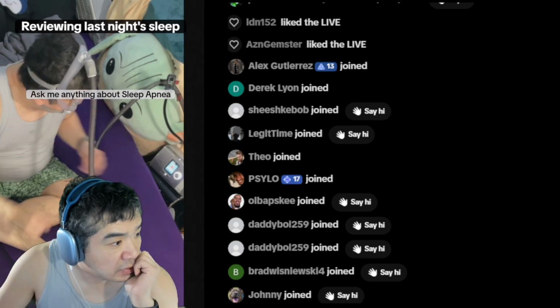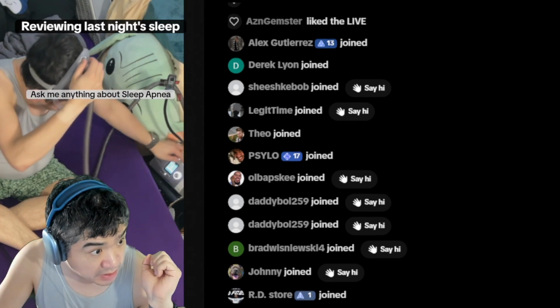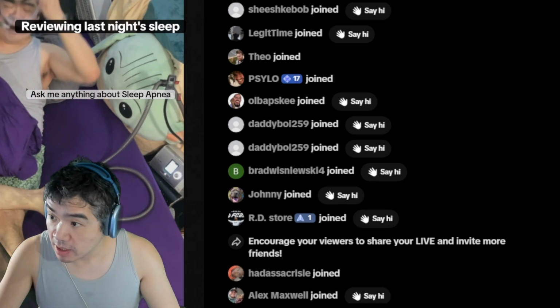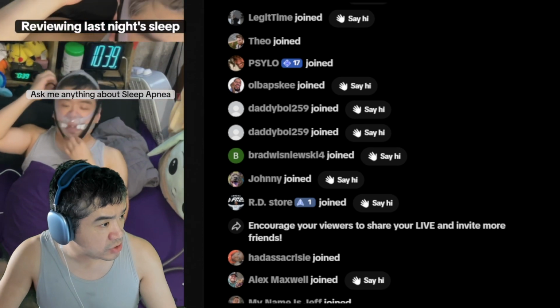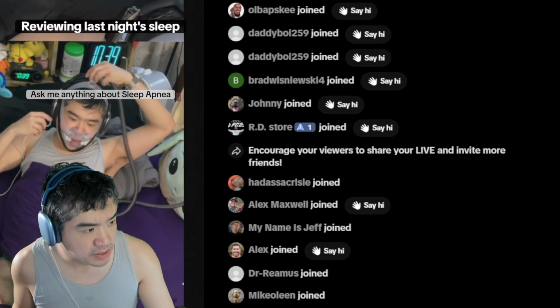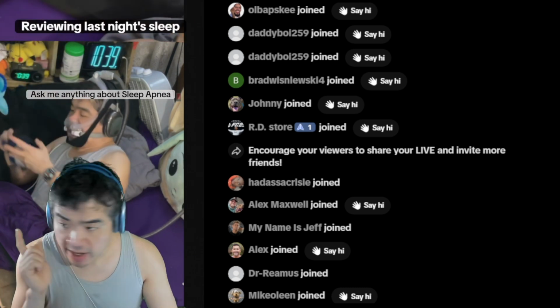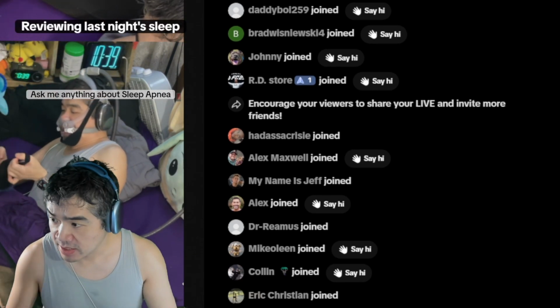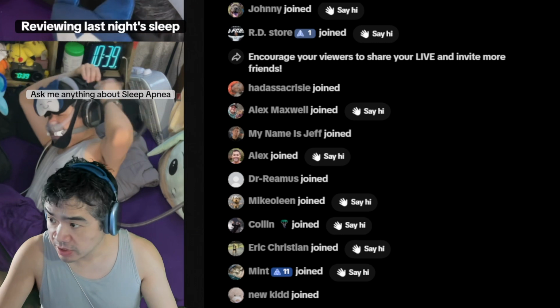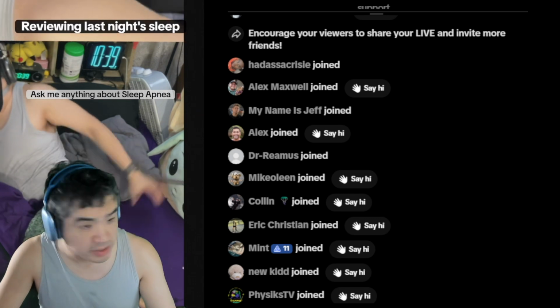Right now, I'm doing what's called a fit test, where I make sure that the mask actually fits before I get in the bed with it. And then next thing I put on is a chin strap. That's not part of my sleep apnea treatment per se, but it is something I've added for extra support. The other thing you may miss me adding was my AirPods. That's for noise cancellation. I click the hose in. The hose connects the mask to the machine. I had to unclick the hose real quick to slip my eye mask under there, and I'm all set for bed.